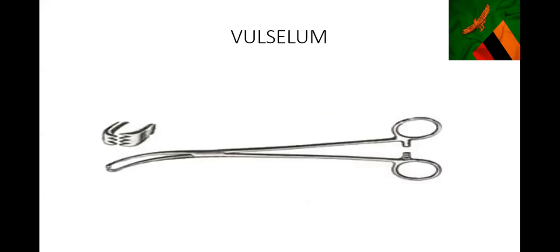This is a Vulsellum. The way to identify it is that it has rat-tooth-like teeth - three on one side and four on the other - and it has a lock on the handle. Also, when you lock it, there's a gap in front which doesn't close. So even if the teeth close, there's a gap in between. That's the Vulsellum.